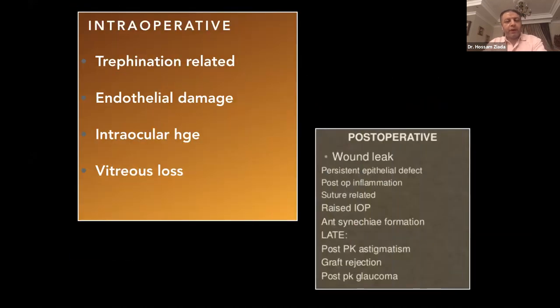So the complications of PKP, either intraoperative or postoperative. The trephination related complication could be one of the important and dangerous complications during surgery. How to avoid the trephination related complication, and how to do the trephination properly? Please, Dr. Mahmoud, give us your tricks and tips about the trephination.